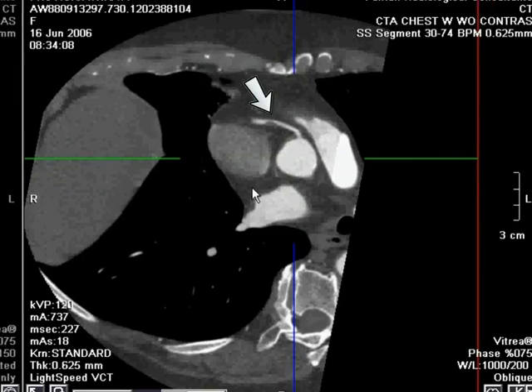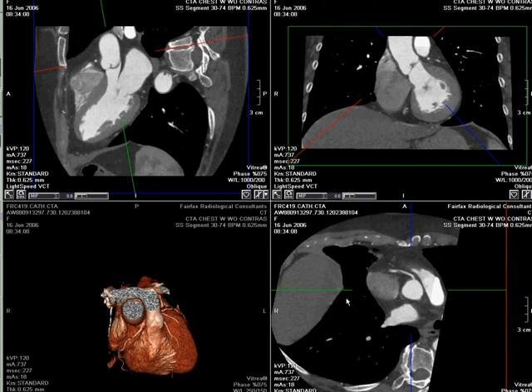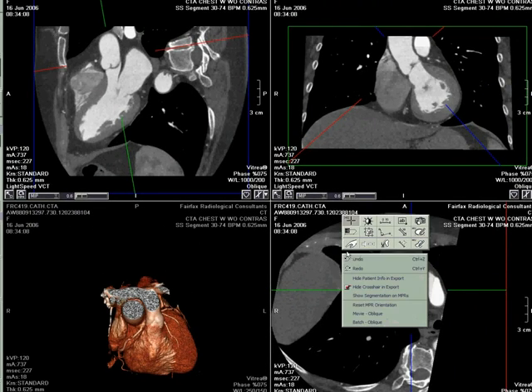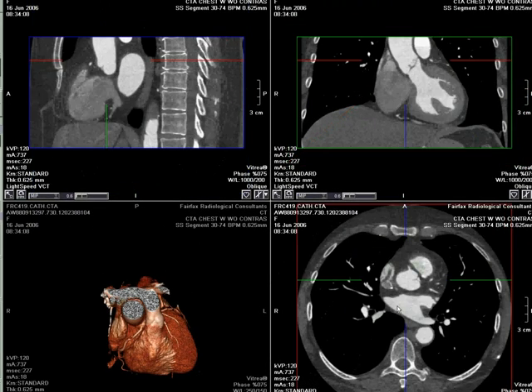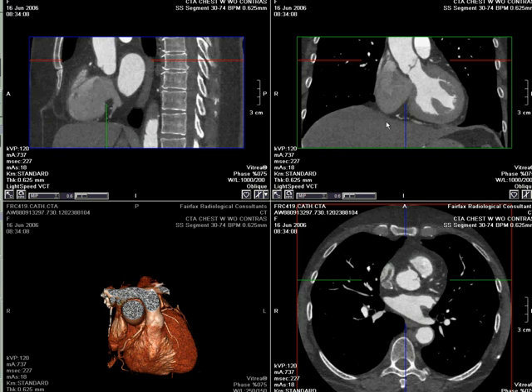The next thing we need to do is use multi-planar images to obtain a view of the right coronary artery that shows its course and also shows whether there is calcified or non-calcified plaque within the vessel, and if so, try to assess the amount of stenosis this causes.